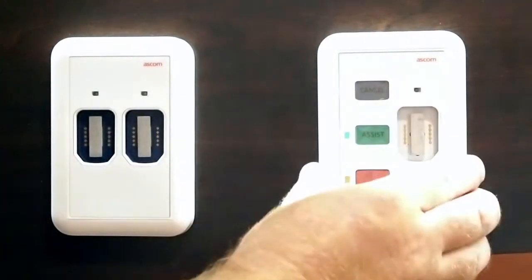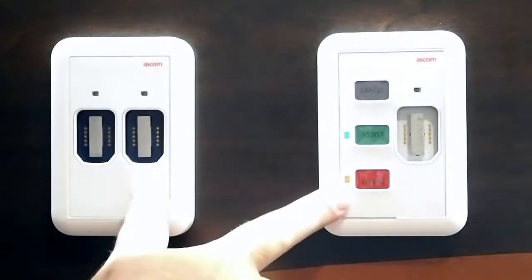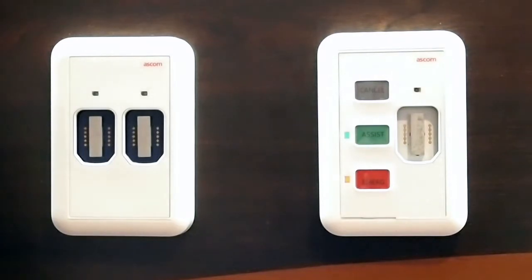The bedside module has three configurable buttons. As configured, we've got cancel, assist, and staff emergency. These can be reprogrammed. There is a piece that comes out that can be printed on site, so you're not buying any custom products from ASCOM.